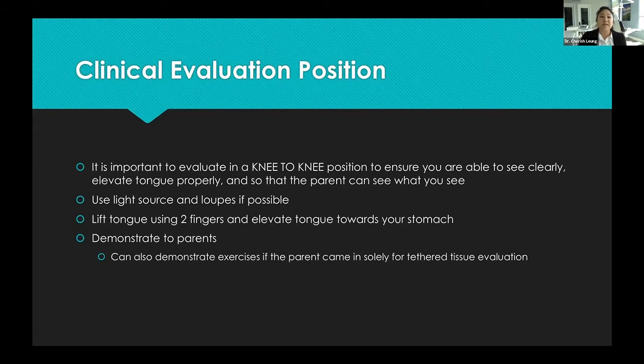You want to lift the tongue using two fingers, one finger on either side of the tongue, and you're going to pull that tongue towards your stomach, so up and backwards. And then you can demonstrate at that time, if for sure the parents know they want to do a frenectomy, like if they came in specifically for that reason, you can also at that time demonstrate the exercises that they're going to have to perform after the procedure, because it really helps them to be aware of what they're getting themselves into, because that part is the least fun. And so I'll show you that at the end.